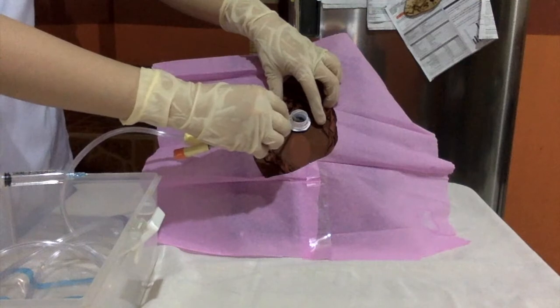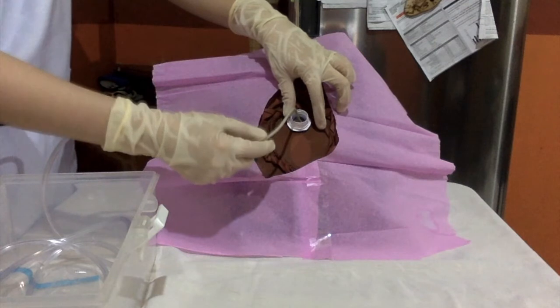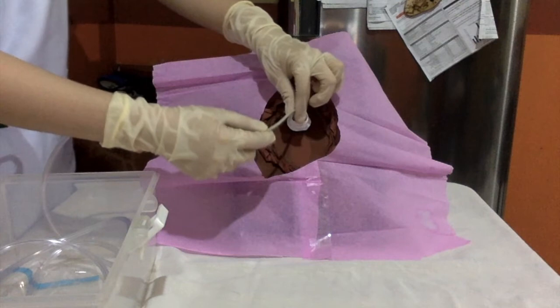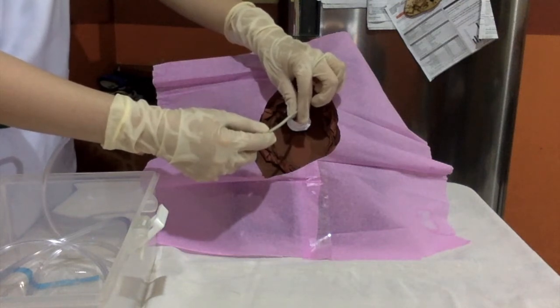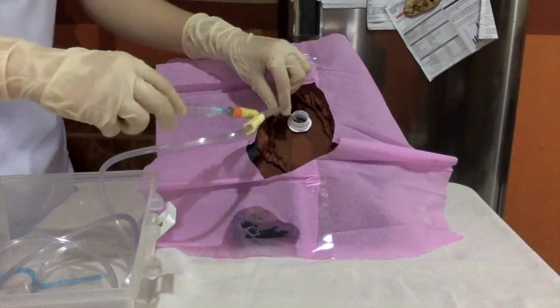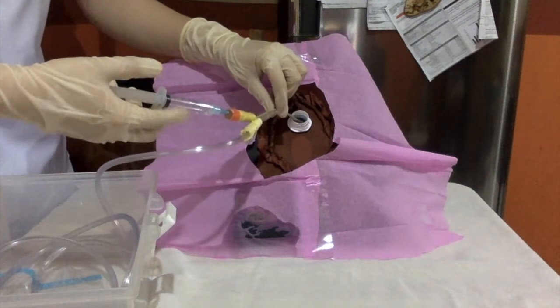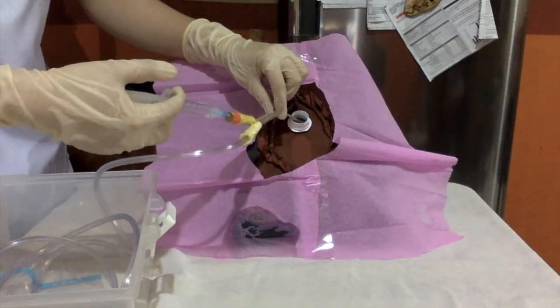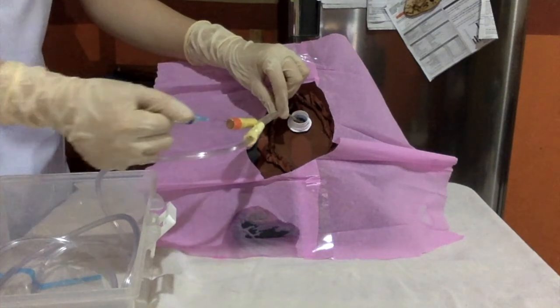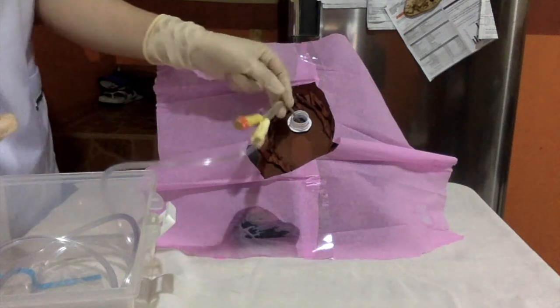Okay. I will now grasp the catheter with the thumb and the first finger of my non-dominant hand and hold steadily. So this is done to keep the catheter from being forced out by the sphincter muscles and avoid contamination of the distal portion of the catheter. I will now inflate the balloon with the attached syringe. So let's assume that this is a 10 ml syringe with 10 ml of sterile water. Then I will gently pull back on the catheter until it stops.